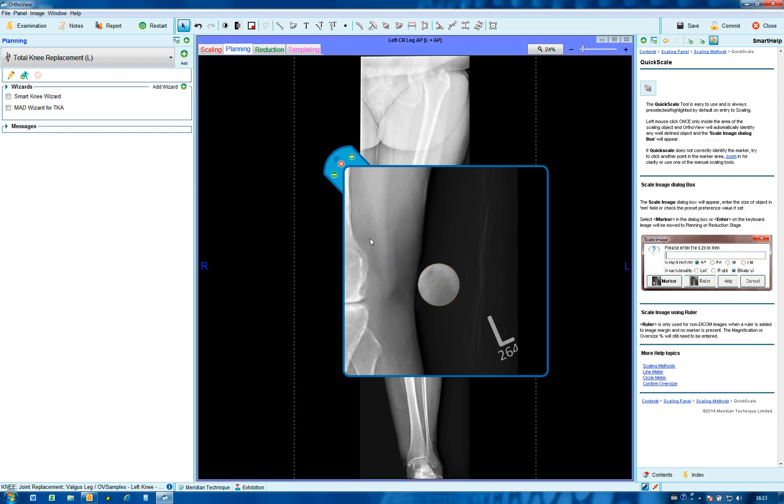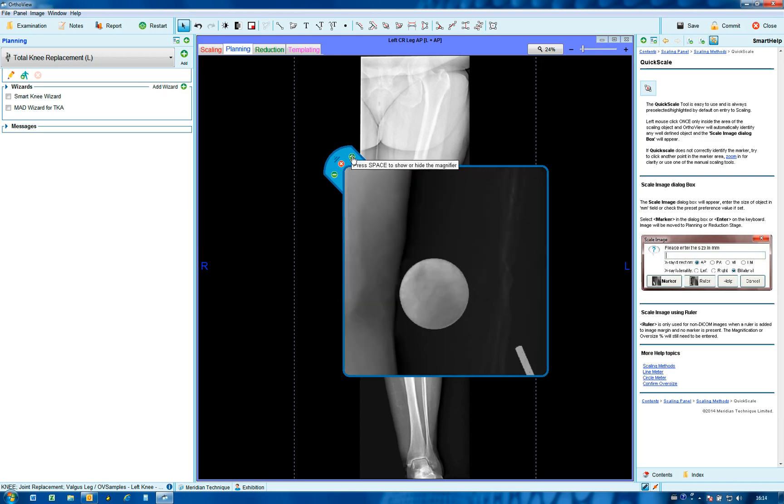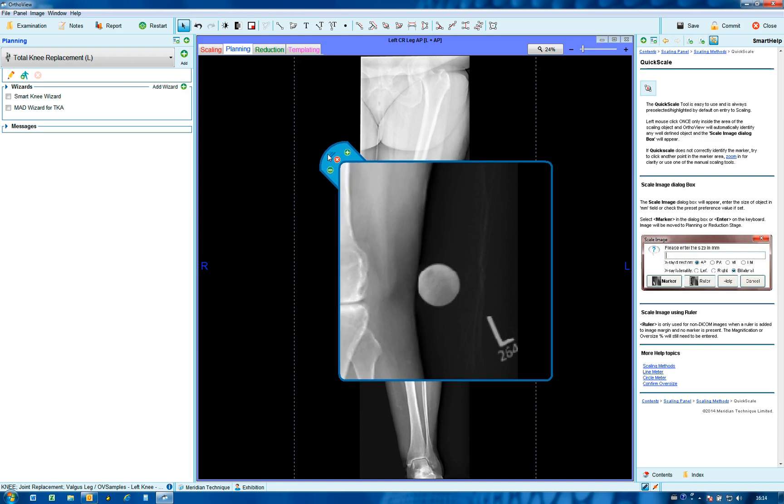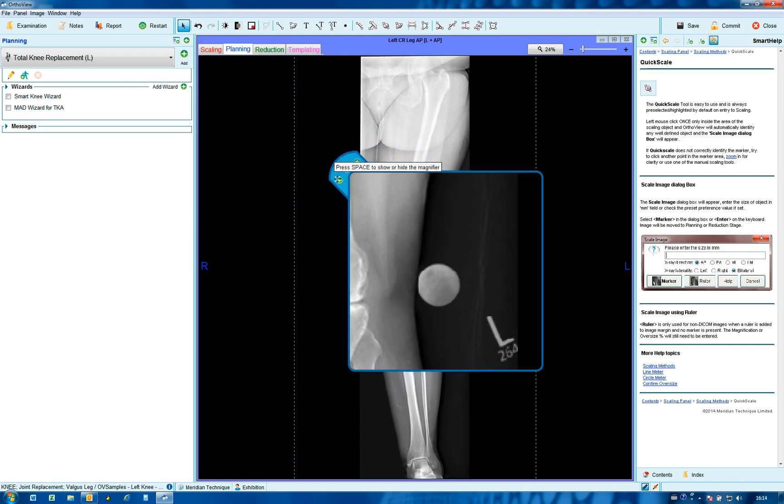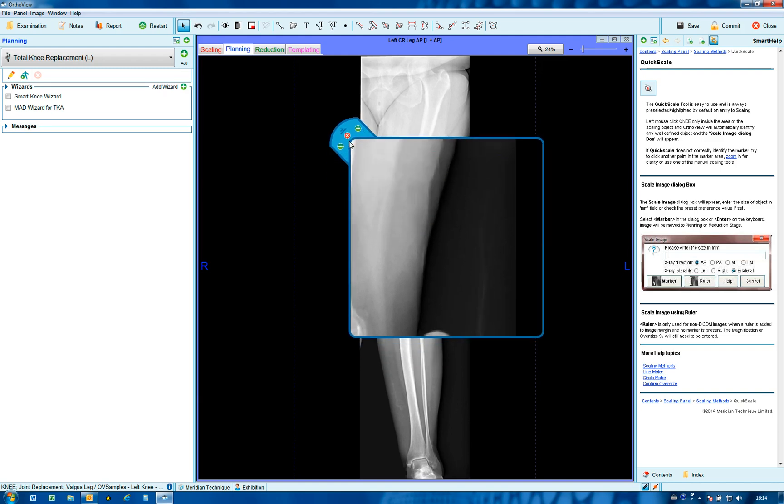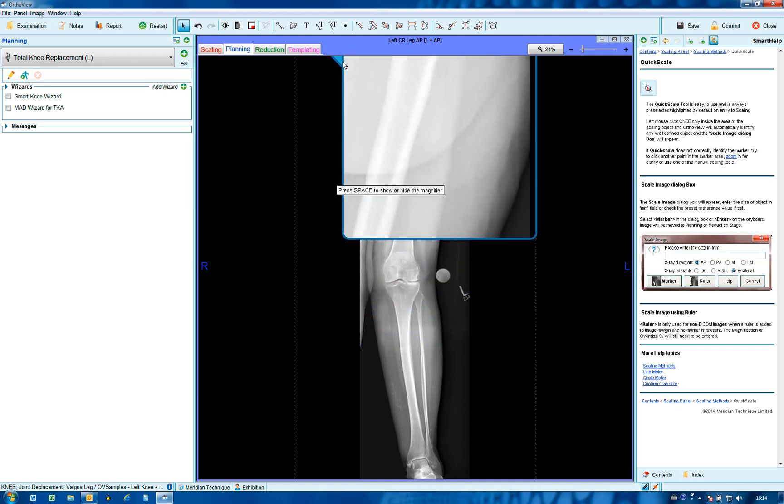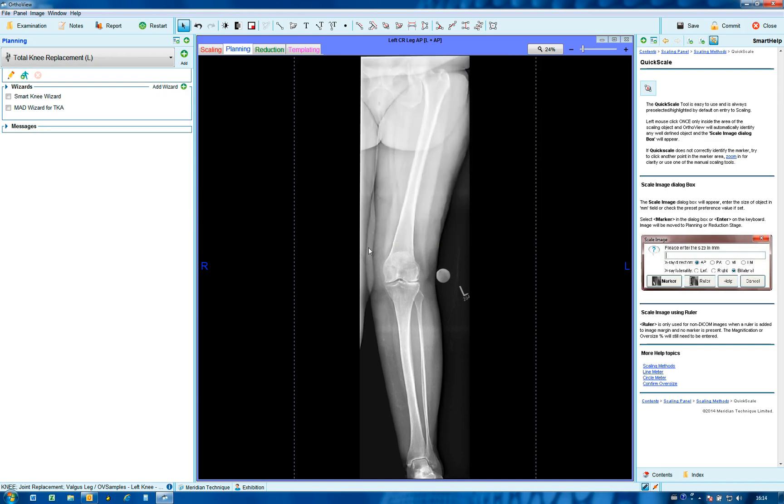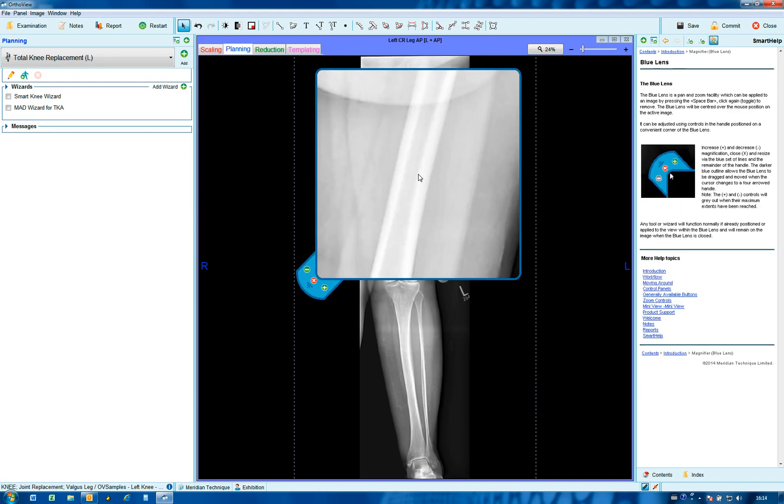The blue lens magnifier will remain as you move to the next screen if it's engaged, and it can be used to increase zoom, decrease zoom within the area, close, or the size of the handle can be altered. If the handle is not available, it will move to a new point on the screen if you're moving the magnifier up or down or to a corner. To remove the magnifier, again click on the space bar, and it will always appear over the area where you leave the mouse pointer and center to it.